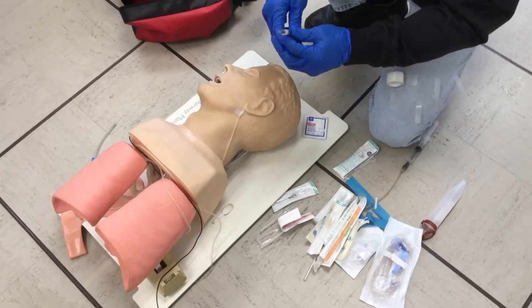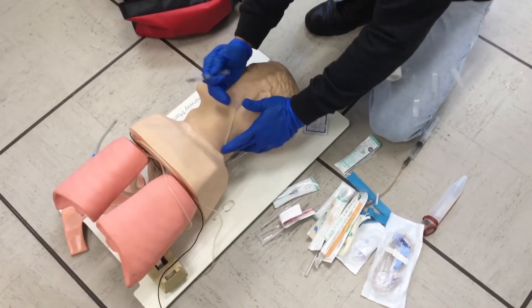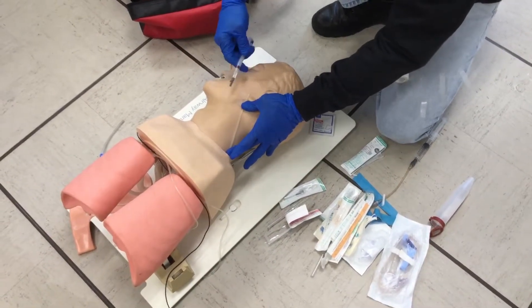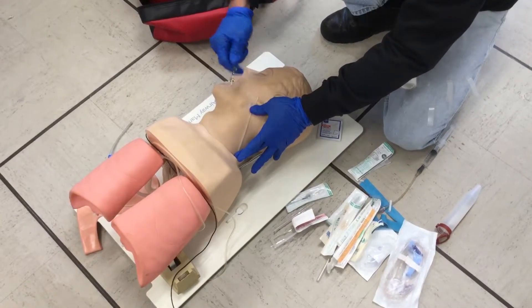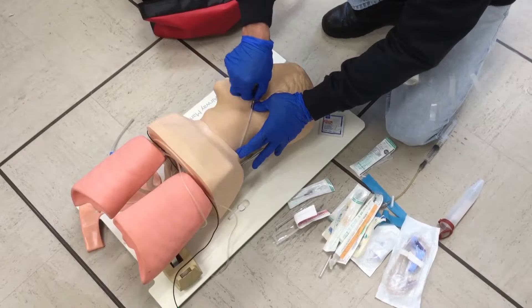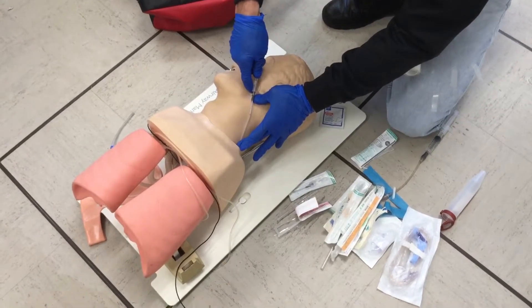Alright, so we've made sure everything is clean. We prepped the site. We turned the head so that it's in any area that we can access. We make sure it's plateaued and flattened out. We're going to stretch the skin away, and make sure we pin the vein down by stretching the skin out. You can hold it down closer when you first start to insert. Go ahead and do the venipuncture. You feel a pop.